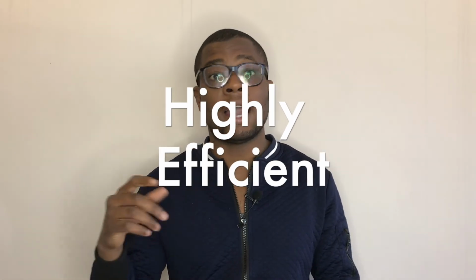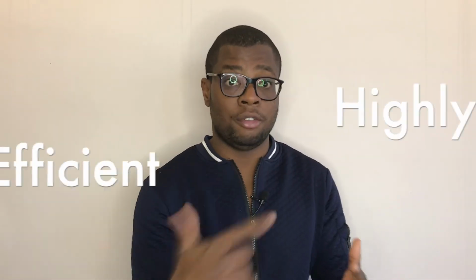So the good thing about hemodialysis as opposed to things like peritoneal dialysis is that it is way more efficient because of the higher rates. Remember, the whole process is very fast, and so it will be useful, for example, if the patient needs acute dialysis for all those 5 indications that we have mentioned for acute dialysis, then it will be useful to use hemodialysis as opposed to peritoneal dialysis.